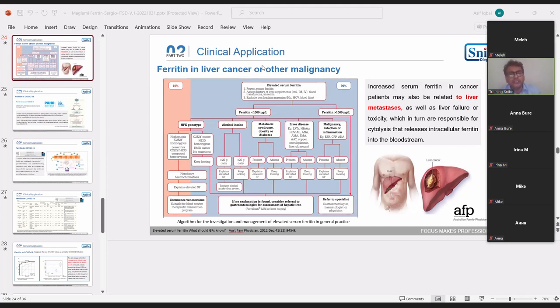So it is better to use batch mode for those analytes which you want to run for a longer period without wastage of the reagent. This is the best practice. If you have low volumes of EPO or ferritin, you order the smaller pack size, or if you don't want to order the smaller pack size, you can use the 100 test kit within 1 month. If 100 test kits are not okay, you can consume within 2 months by keeping the reagent sealed in a refrigerator. On the basis of need, you can load it and then run it. So this is the right answer for your inquiry.